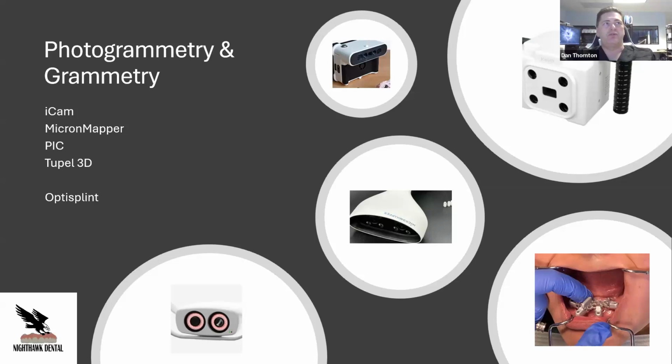They also have the reverse ones where you can put an analog on, like later on for your finals. I'm putting an analog on your temporary where you can do the scans using analogs that will become your scan bodies so you can make the final zirconium. It's very interesting how much we are changing in dentistry from the old traditional pickup impression, verification jig, let's verify the implants, let's do the model work, do all the setups, do the wax try-ins, that now I'm so excited because it's 100% digital.